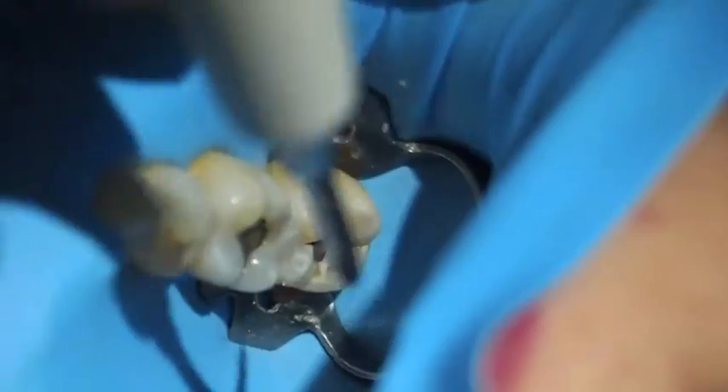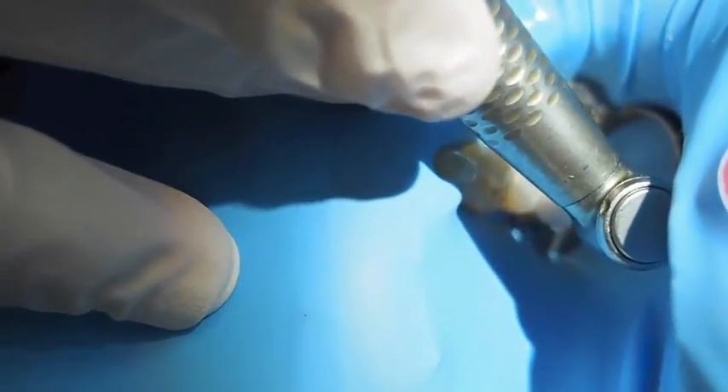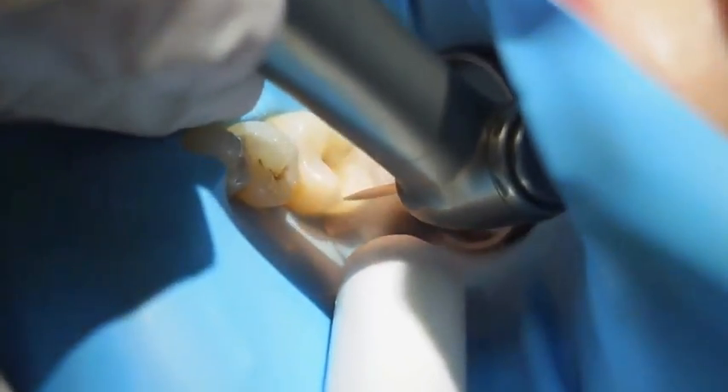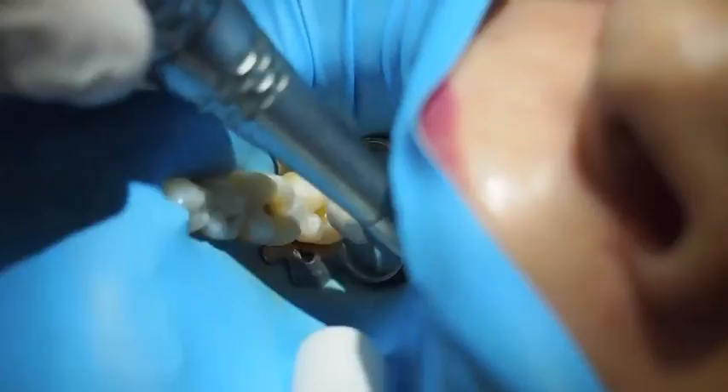Just using ultrasonic to clean off any plaque and stain. If you have a sand blaster that will be quicker. This is a polishing disc and then obviously the high speed to remove the old fillings and caries. Very fine flame diamond just to clean out the fissures so that there's no stain — you can't bond to stain. Some pumice; that's for people who can't afford a micro etcher.